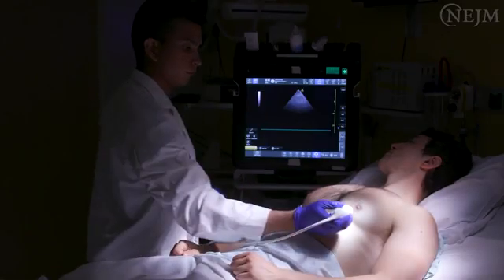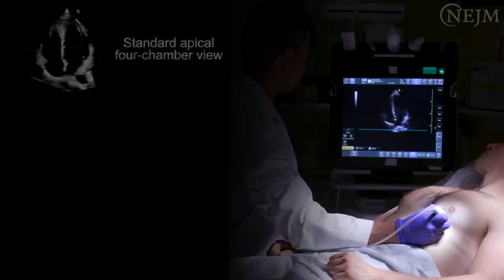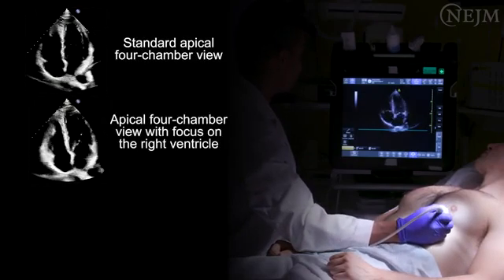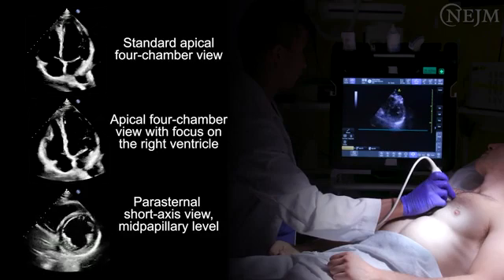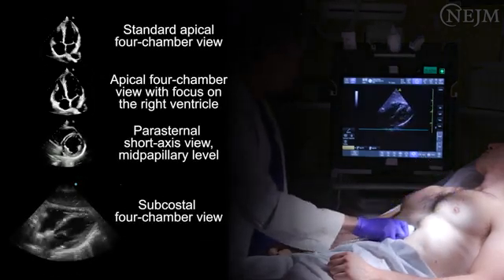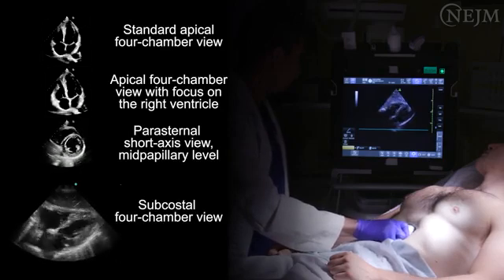To begin your evaluation of right ventricular systolic function, obtain images first in the standard apical 4-chamber view, then in the apical 4-chamber view with focus on the right ventricle, next in the parasternal short axis view at the mid-papillary level, and finally in the subcostal 4-chamber view. The subcostal 4-chamber view is described in the supplementary appendix to this video.